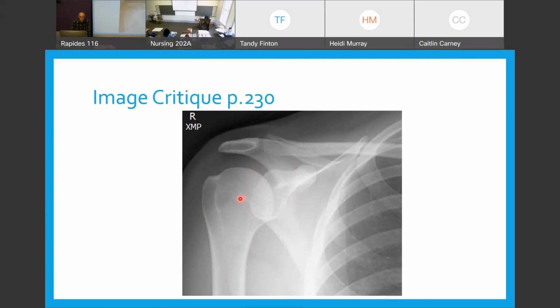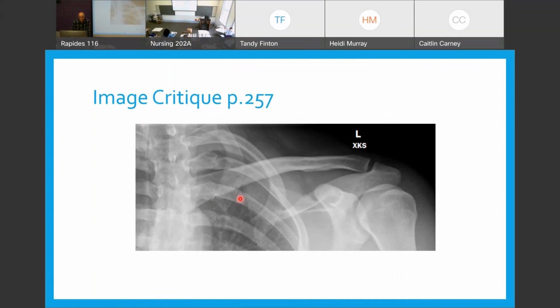You good now? Okay. All right, image critique. Tessa, thanks for volunteering. Let's go. What is the projection? It is an AP projection of? What are you looking at? My iPad, at the image. Okay, I didn't know I could do that. Oh, cool.